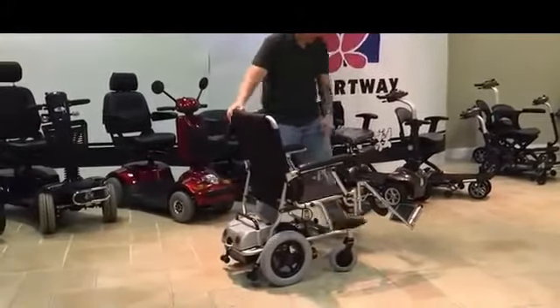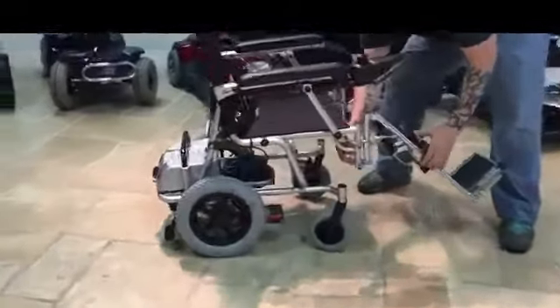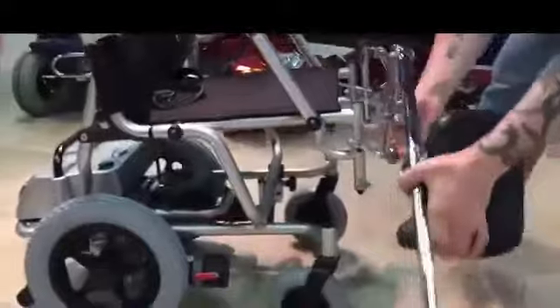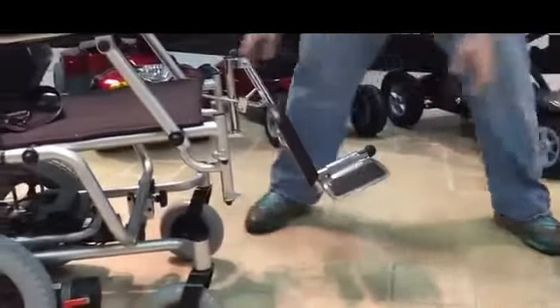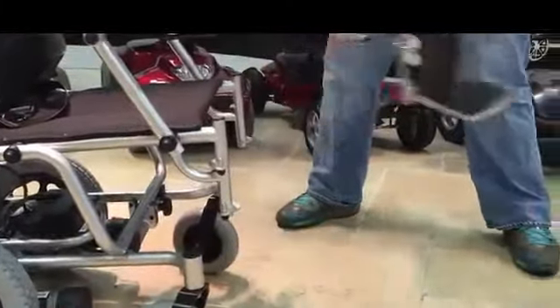This is the disassembly of the P15. First we're going to start with the leg rests. There is a lever right here. You pull the lever — again, the lever. We'll swing it out and remove it.